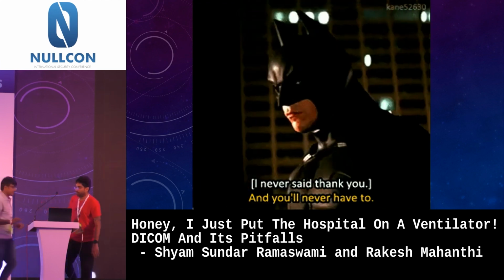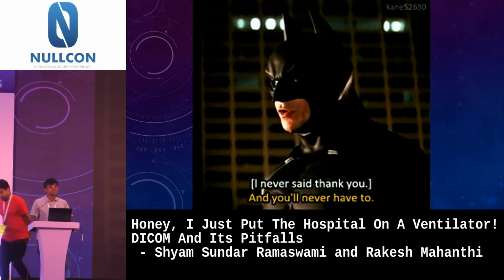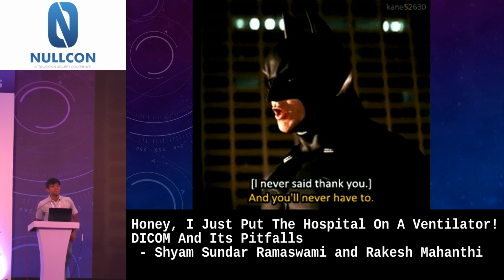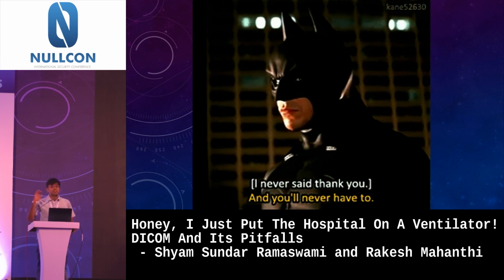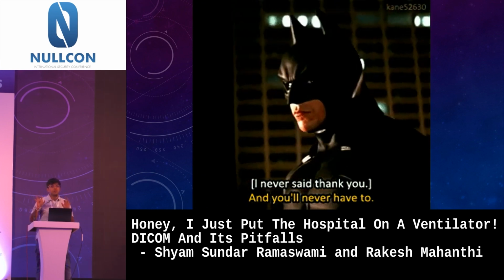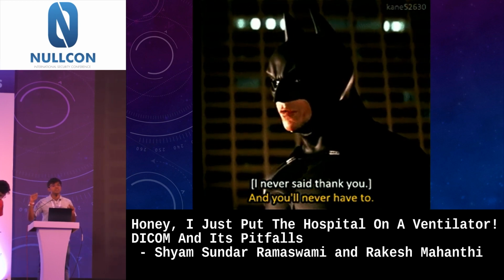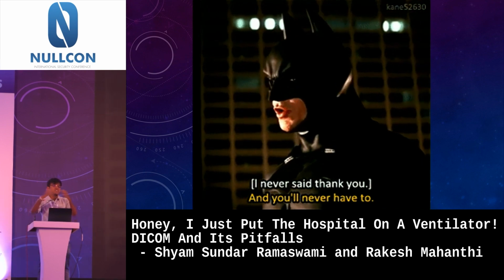You want to take it? Go ahead. I'll try to explain that. What you asked is valid. So the challenge is to put this DICOM into the hospital network, right? But unfortunately, most of the hospitals are going cloud, and many of the services are currently sitting in the cloud, like the PACS server which I have just shown you. So if there is any glitch in that particular cloud endpoint, if something is leaking over there and it goes into the PACS, then it can easily spread across.